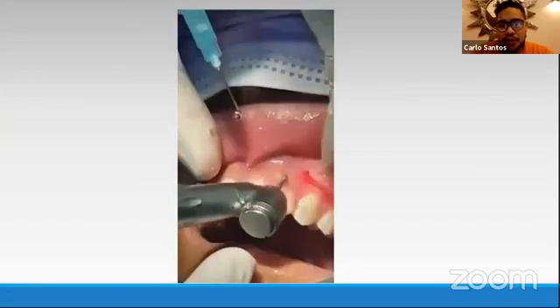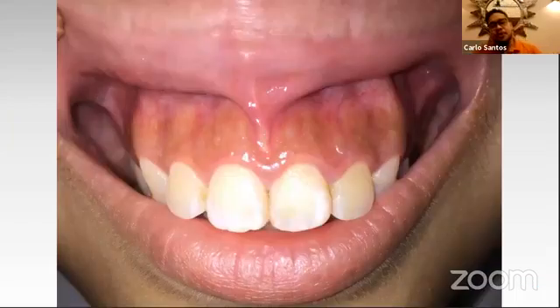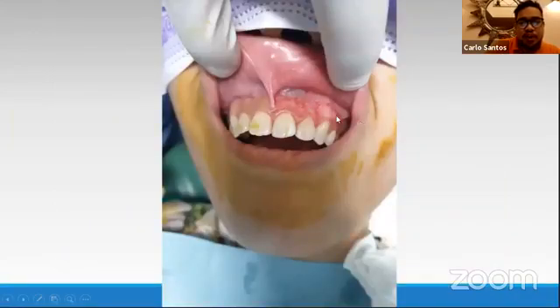So copious irrigation, of course, given that you did your hemostasis properly, you see the bleeding is very minimal. If you place your index here, this would fall around 1 or 2. The melanin is not that significantly dark, but the patient is actually concerned about that pigmentation, the brown stains. We were actually concerned about her gummy smile, but she wanted just the pigments to disappear. With what Dr. Loleng was doing a while ago, you can see the difference from the right portion to the left portion.